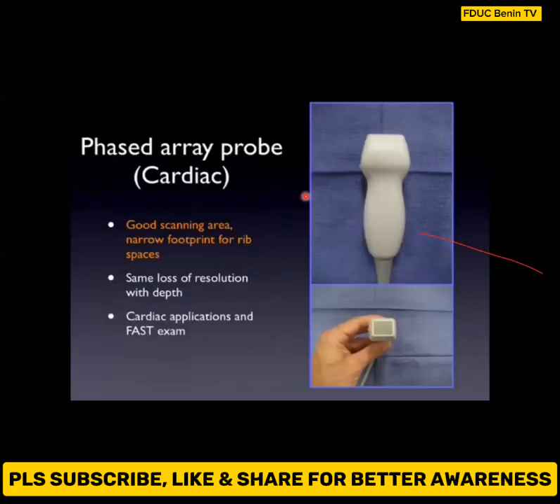Then the phased array probe is what is used by cardiologists. It also uses low frequency, so it has loss of resolution with depth.